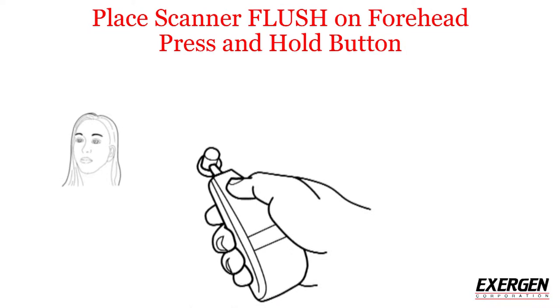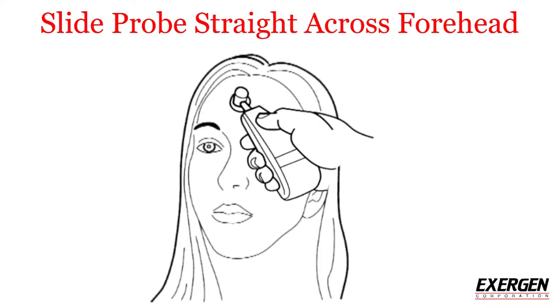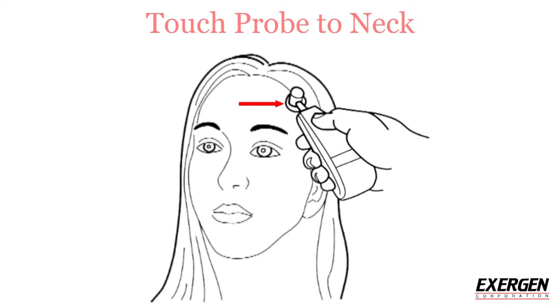Press and hold the button down on the scanner and keep it pressed until you're done. It's important that the probe is fully flush against the skin. With the button still pressed down, slide the probe across the forehead only — not down the side of the face.